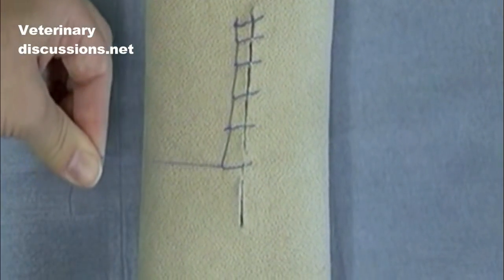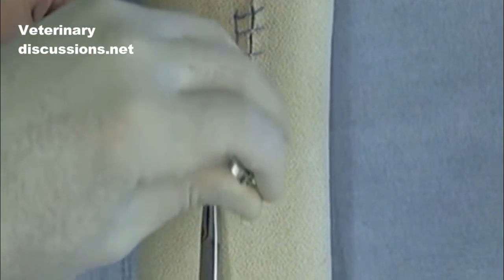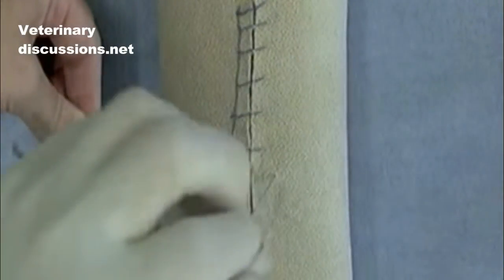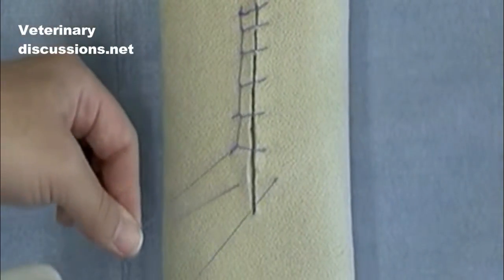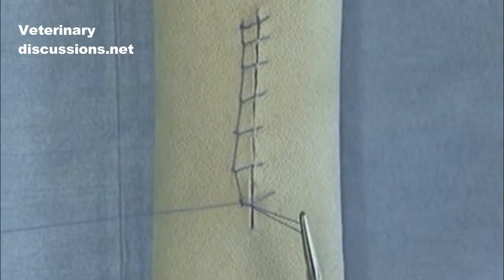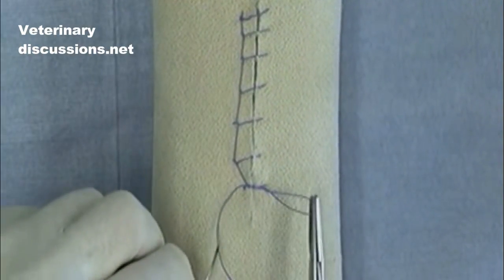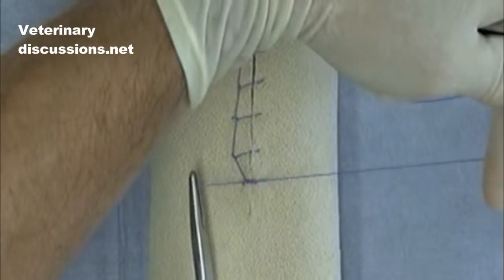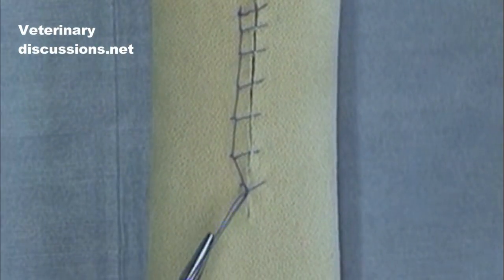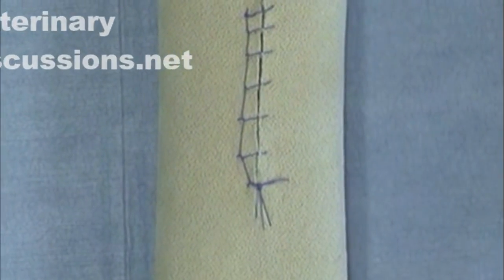To end this, we're going to end it in a backhand suture bite and tie back to the loop, thus finishing the classically considered forward interlocking pattern.